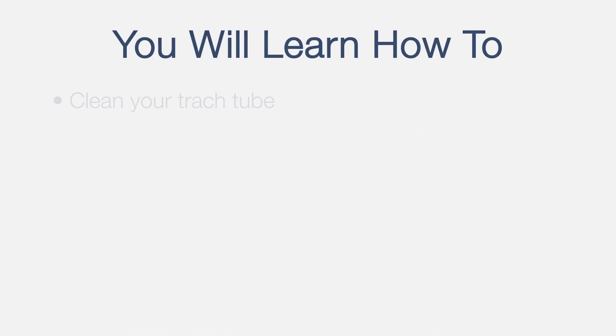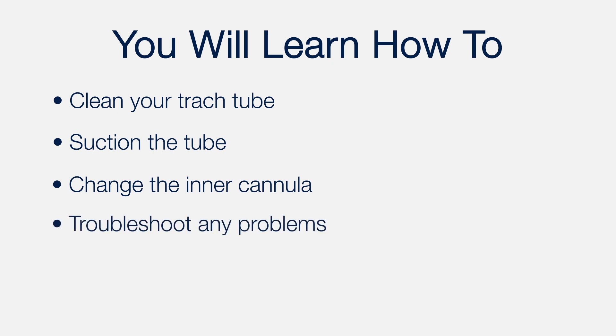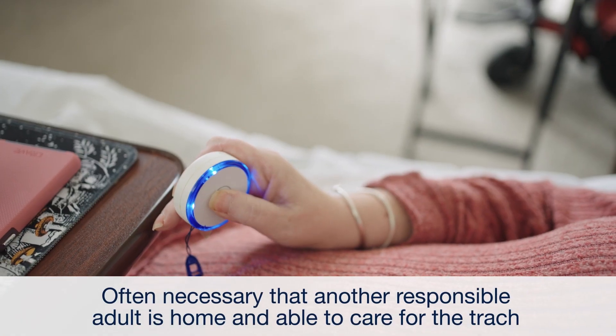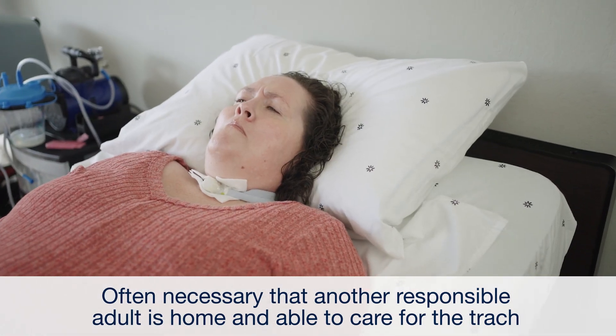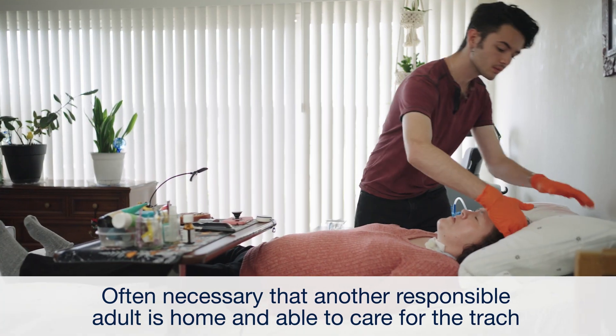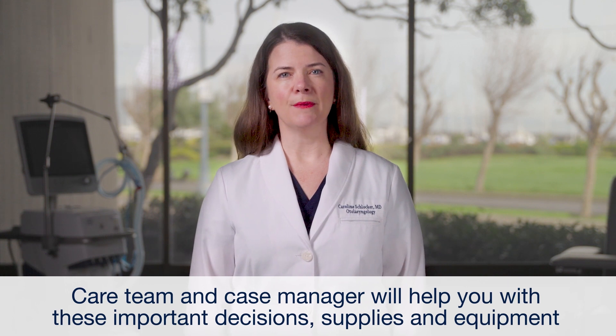The training is complete when you are comfortable with trach care and your supplies are delivered to your home or, in some cases, a long-term care facility. Before you leave the hospital, you will learn how to clean your trach tube, suction the tube, change the inner cannula, and troubleshoot any problems. It's often necessary that another responsible adult is home and able to help care for the trach. Some patients and families hire caretakers to help with these duties, others enlist family members. Sometimes patients do not have the resources to care for their trach at home and must be cared for at a long-term care facility. Your care team and case manager will help you with these important decisions, supplies, and equipment that may be necessary.